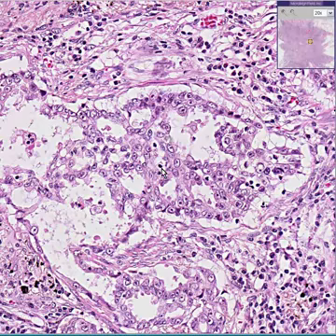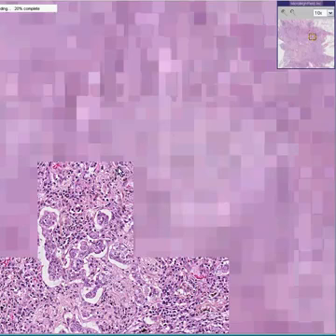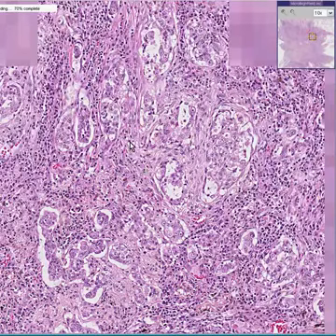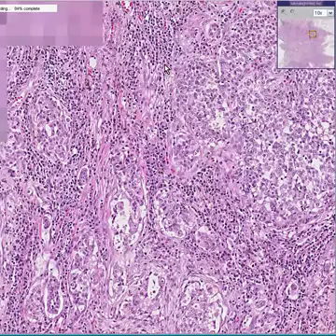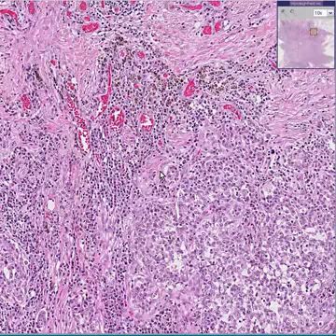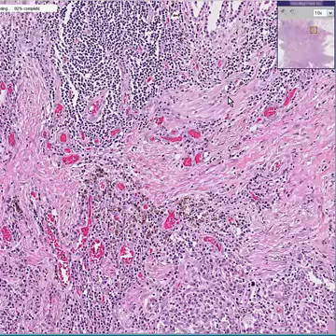And if we go out towards the periphery of it and back down a little bit, we will see that as per the immune reaction to this tumor, we're probably going to see more lymphocytes, perhaps at the periphery. We could already see them scattered throughout here and here and here in the middle, but we could see some reaction to this tumor out at the periphery also, in which we have larger collections of lymphocytes attacking it around the edge. I don't think I want to say anything more.